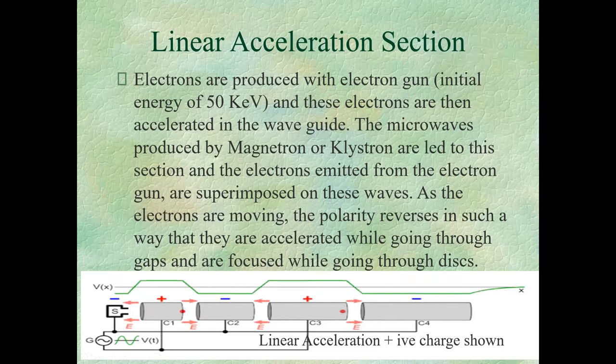If your monthly output has an upward trend, and usually that happens with temperature and pressure also. One of my machines, a TrueBeam machine, we run it on city water, unfortunately, and I have to adjust the outputs whenever winter comes or summer comes. In every change of season, I have to adjust my outputs, but that's temperature and pressure dependent. But if you see a continuous upward trend, irrespective of the change in season, then you may get your engineer on notice because your ion chamber may be going out.